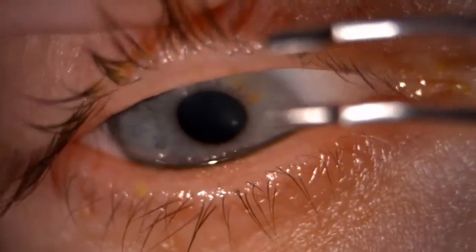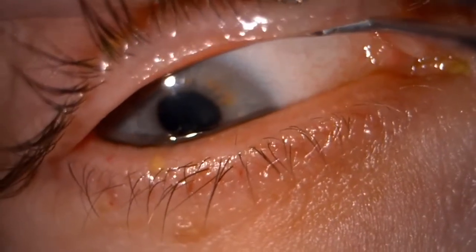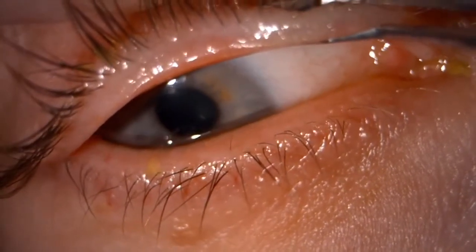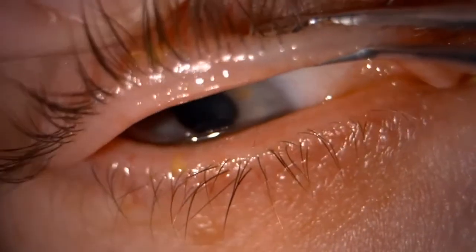Having used local anaesthetic, to do the top lid you just sort of roll out the edge of the lid and again make sure the paddle is behind the lid margin, then press along the edge of the rolled lid margin.